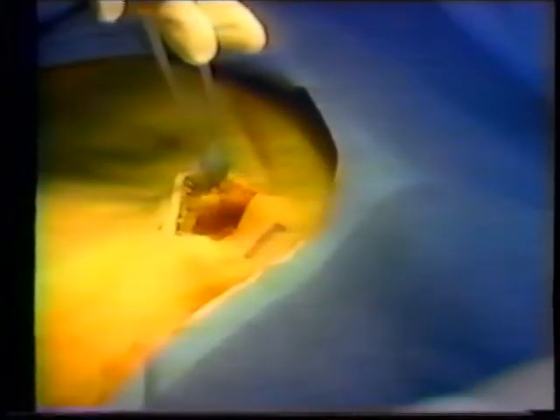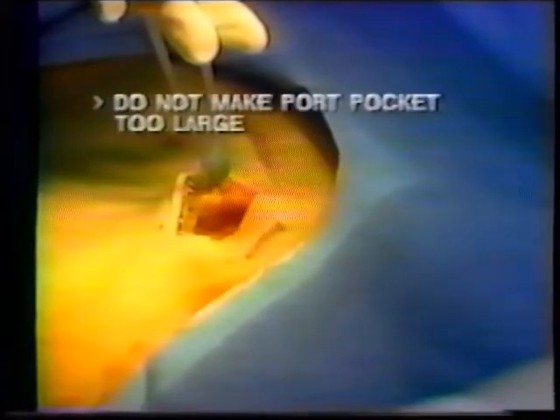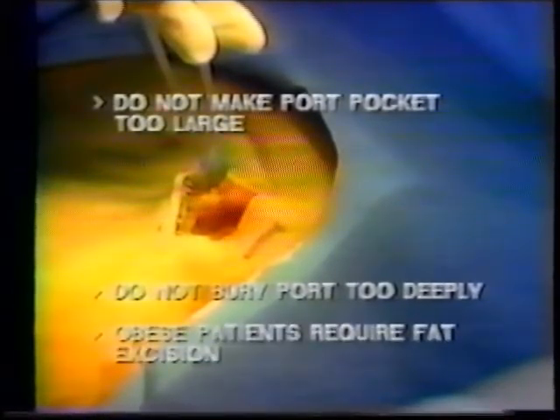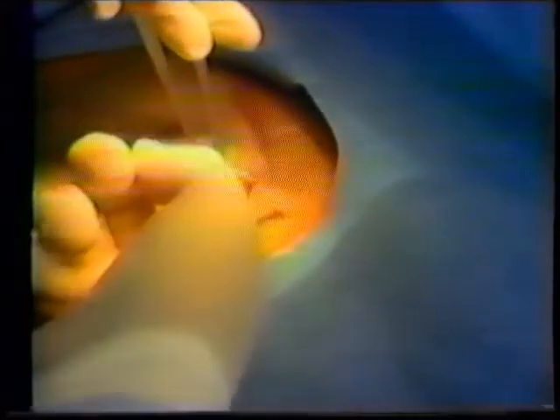After making a four to five centimeter long incision, develop a port pocket by using blunt dissection. Take care not to place the incision line directly over the eventual site of the port location. Do not make the port pocket larger than the port base. Do not bury the port too deeply — five to six millimeters is usually adequate. Obese patients may require some fat excision for proper placement. A finger can be used to create a subcutaneous space for the port stem.